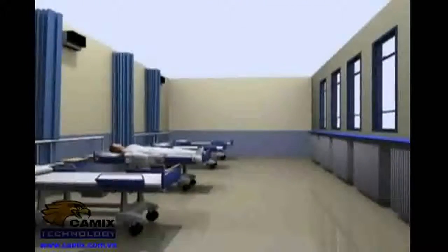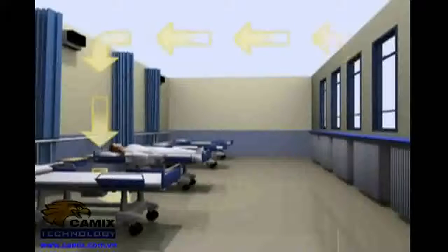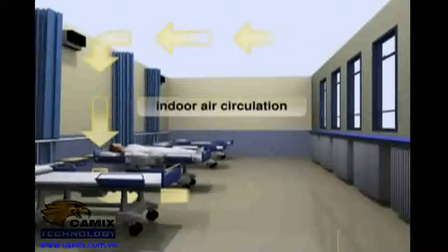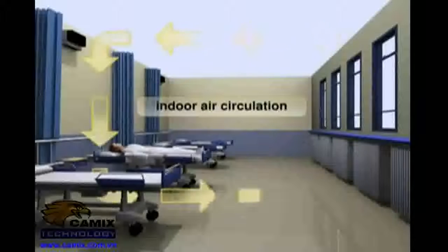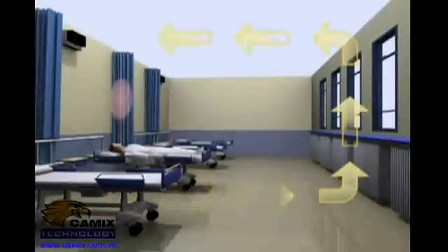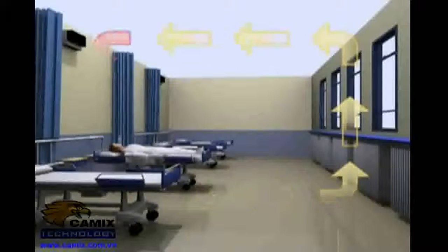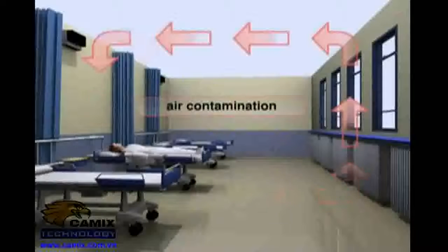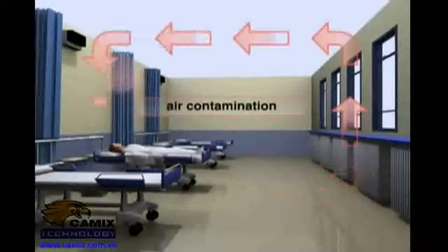There will always be air circulation in the room. The infected air exhaled by the patients will increasingly pollute the air present. When this polluted air flows through a zone radiated by a UVC lamp, the purifying effect will occur, and the existing bacteria, viruses, and other microorganisms will be deactivated. Because of this, an air quality will be created where the level of pollution is so low, the risk of infection will be drastically diminished.